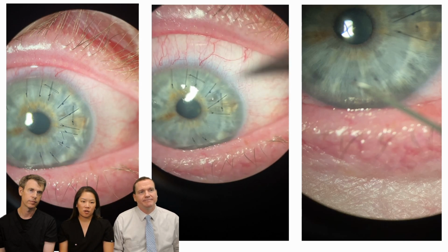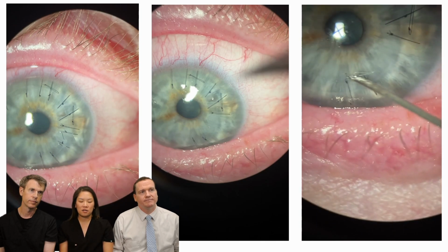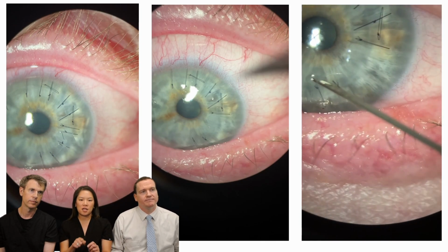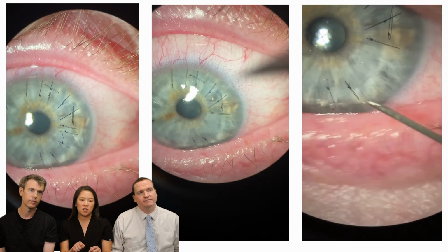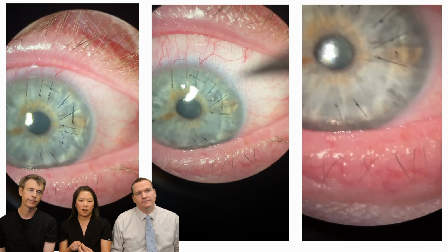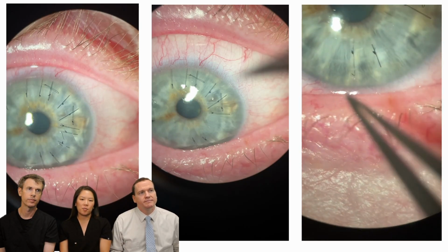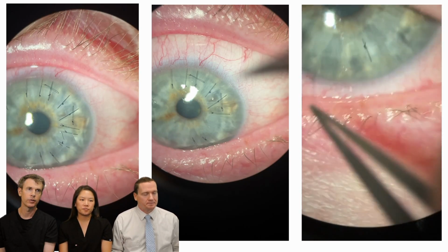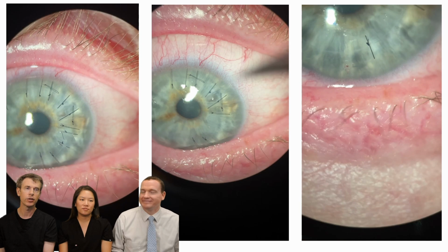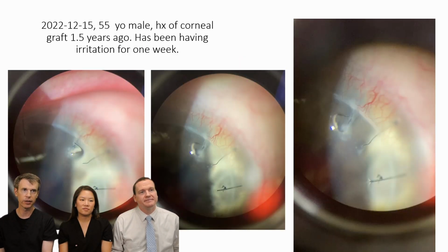One way that we do this, say if you break the suture and you only get part of it out, is you can actually pull the tail of the suture a little bit, whatever is left, put it on some tension, and then use the needle to trim it, and that'll actually retract back so there's no exposure or no tails poking up on the epithelium. Here's another way, even though I said let the knot travel the least amount of tissue: if there's nothing else to grab, I try and get the other side and get it out.